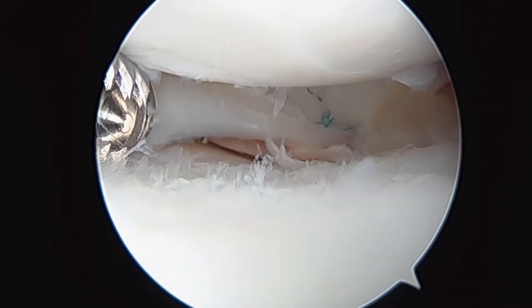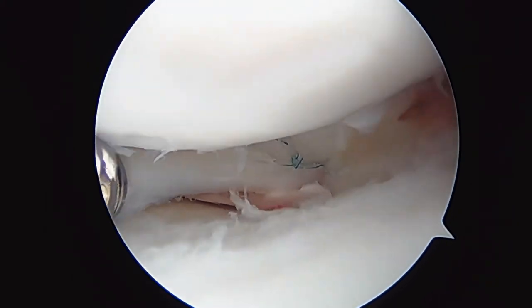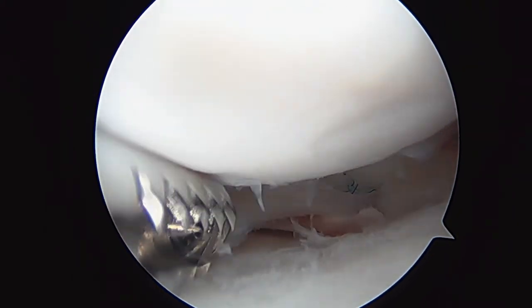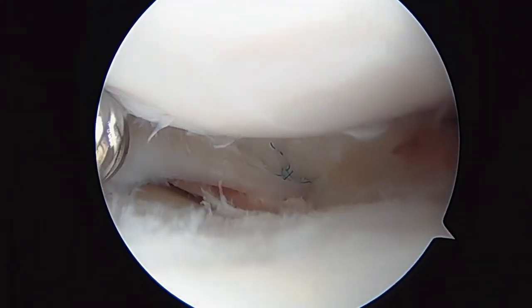We're just trying to irrigate out the lateral compartment. In the distance there you can see the suture that we put in to repair the meniscus. Now we're going to go back and look at the ACL.